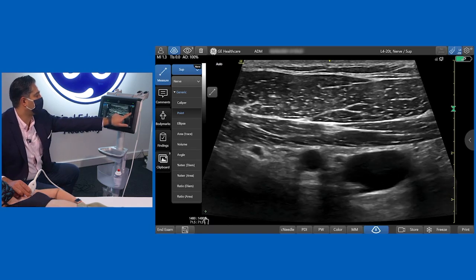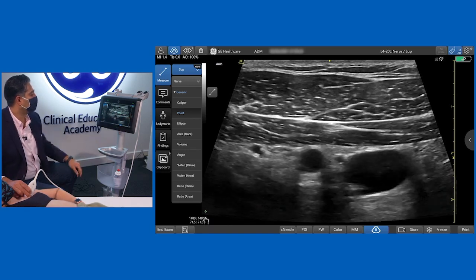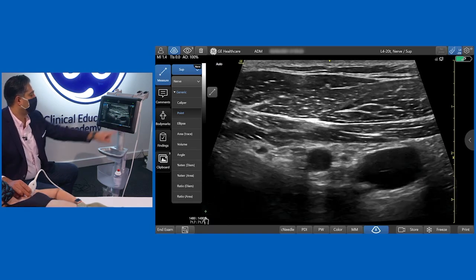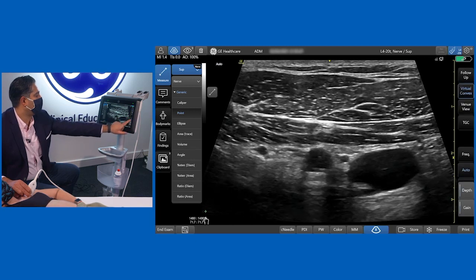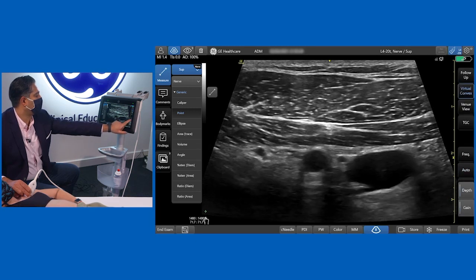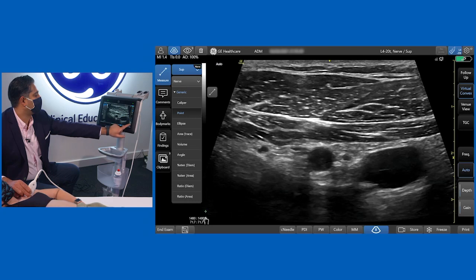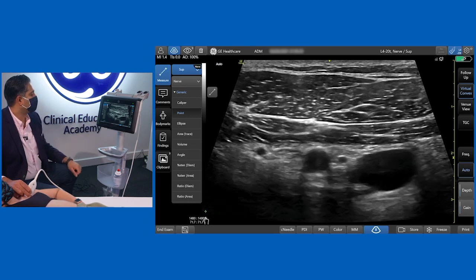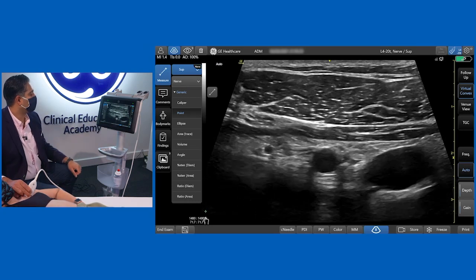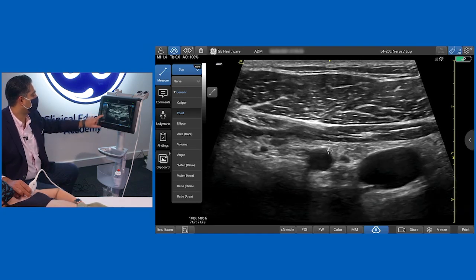This is picked up really nicely, but I can improve things by bringing the focal point slightly lower. Removing the auto gain actually makes a nice difference here. With the focal point where it should be, we can now very nicely demonstrate the axillary artery, the lateral cord, the posterior cord, and the medial cord of the brachial plexus.